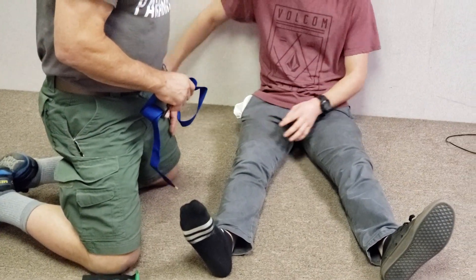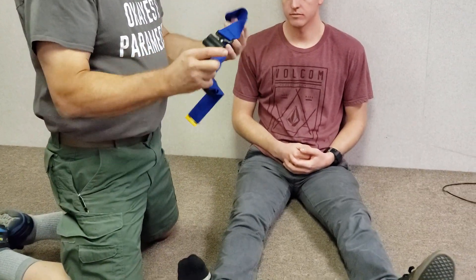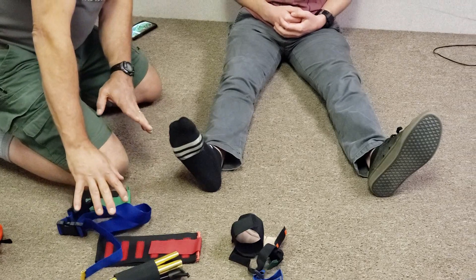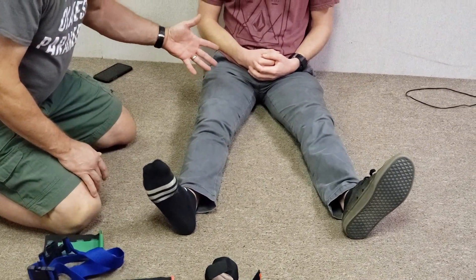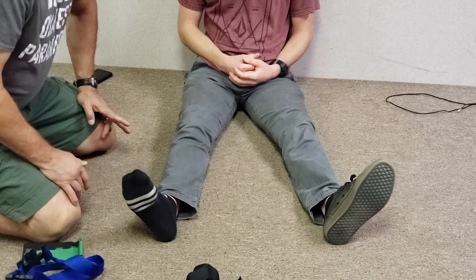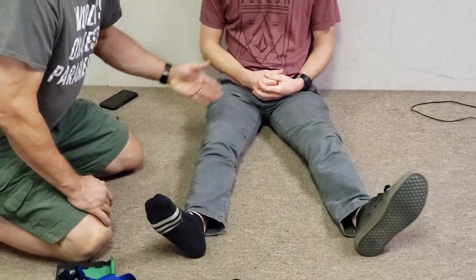You do your normal assessment — identifying that it's a femur fracture and eliminating other major injuries. Those would be contraindications for applying this. The typical contraindications are any fracture, joint, or leg problem from the knee down, and if the hip is dislocated — meaning the femoral head has popped out of the pelvic socket — then you can't use this.